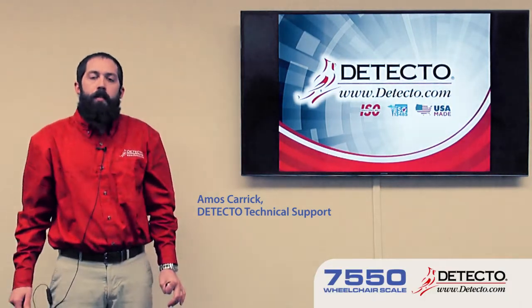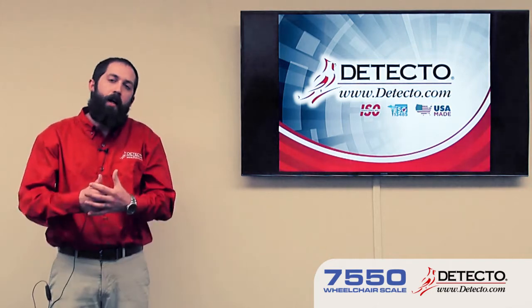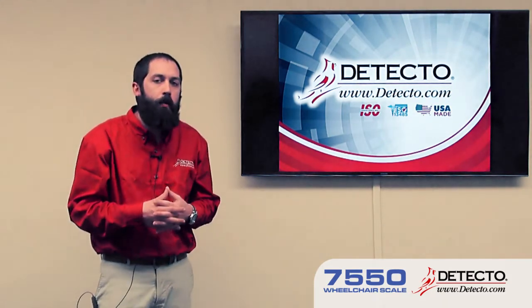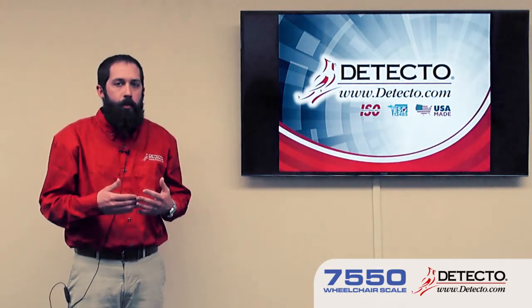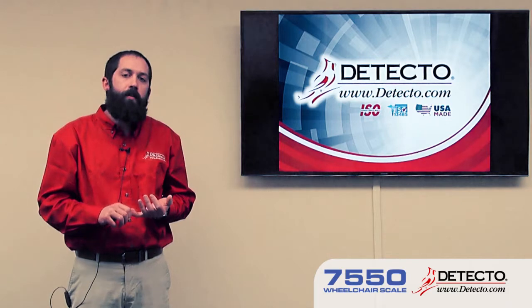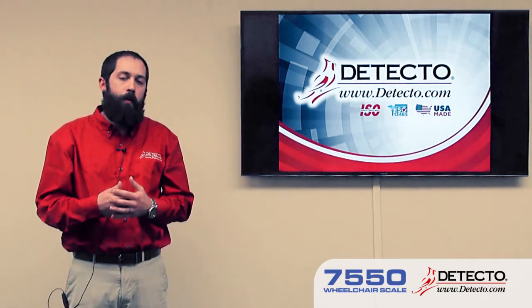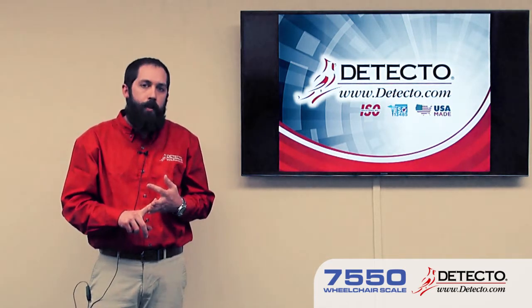Today we're going to be doing some technical training. We're not going to be anything really in-depth, not going to do a whole lot of troubleshooting, anything too technical. What we are going to do is a technical overview of some of our newer scales. We're going to start with the 7550, which has actually been out for a while, but it's still relatively new and good to be refreshed on. We're also going to take a look at the Apex, Solo, and Icon scales.